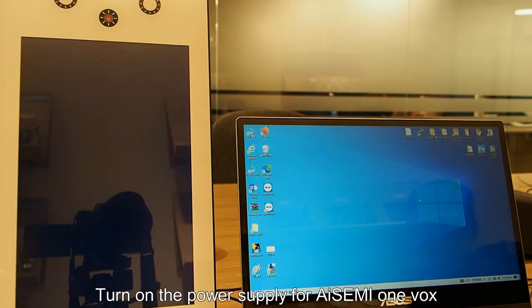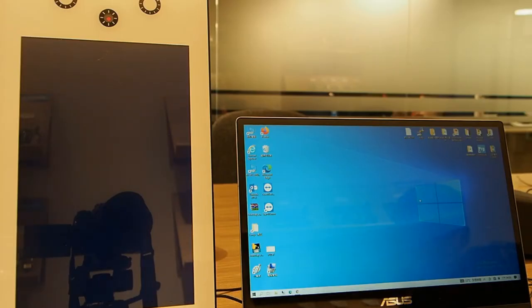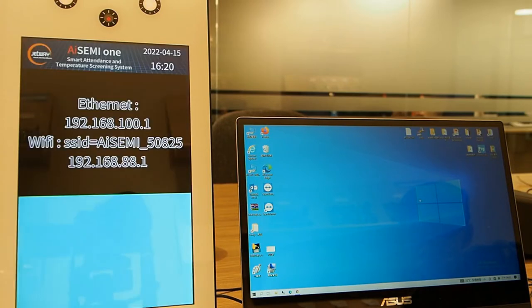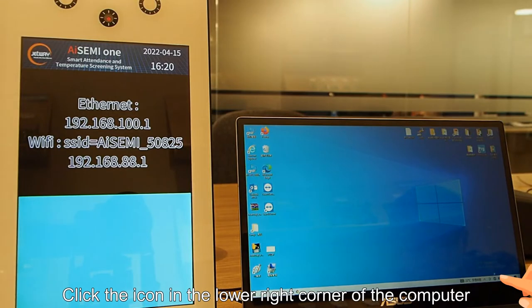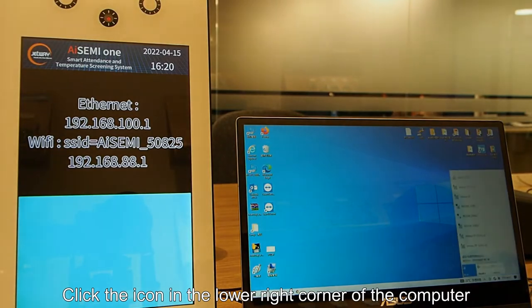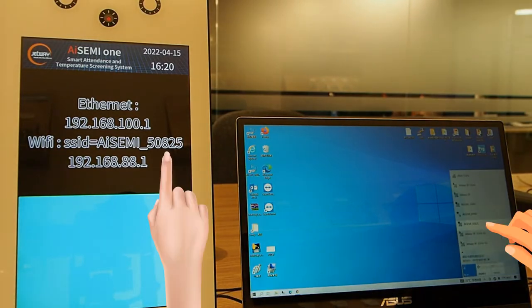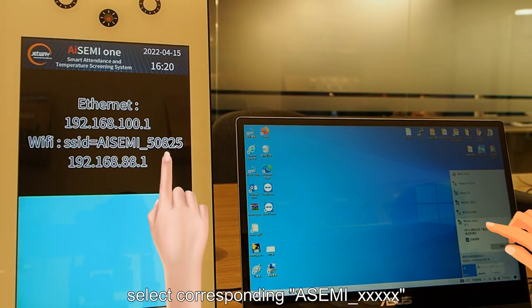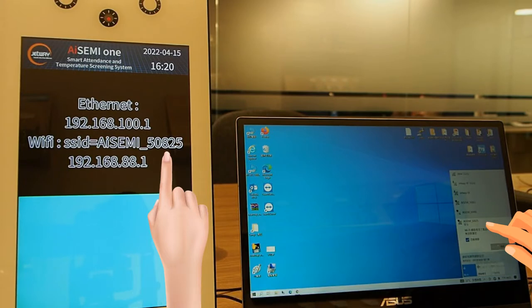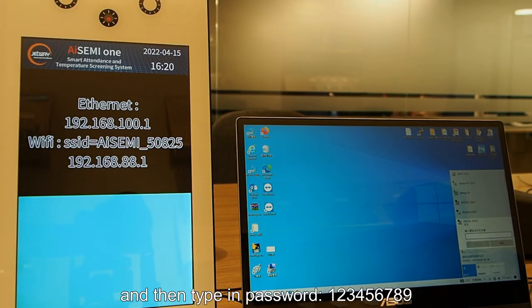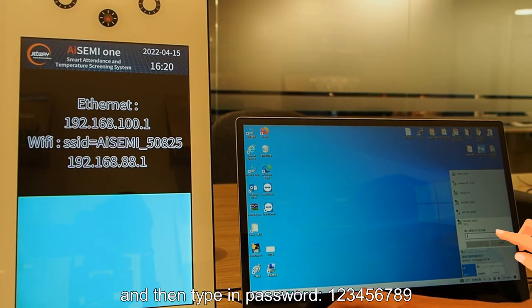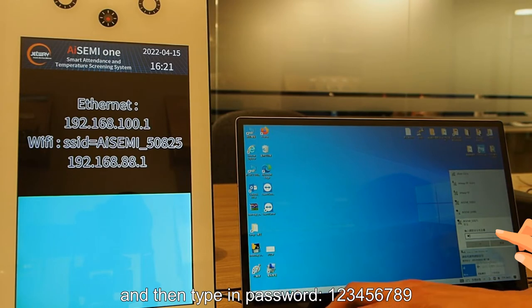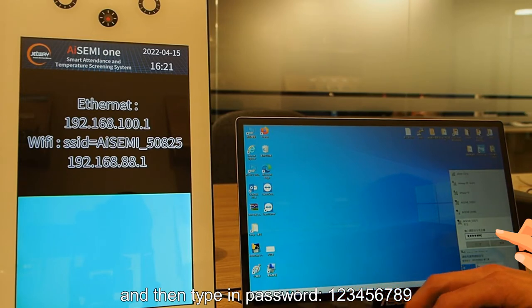Turn on the power supply for AiSEMI one vox. Click the icon in the lower right corner of the computer. Select corresponding AiSEMI and then type in password 123456789.